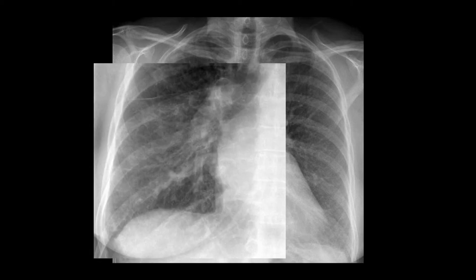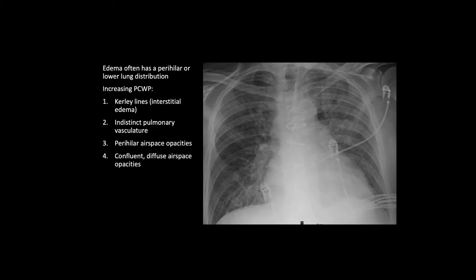Practice will make perfect, but in this zoomed-in version you can really hang your hat on the presence of these small horizontal lines that touch the pleural surface — these are Kerley B lines. So this patient has interstitial pulmonary edema.